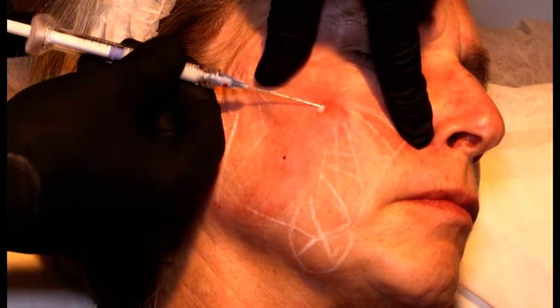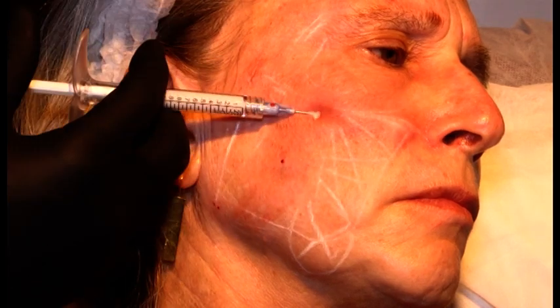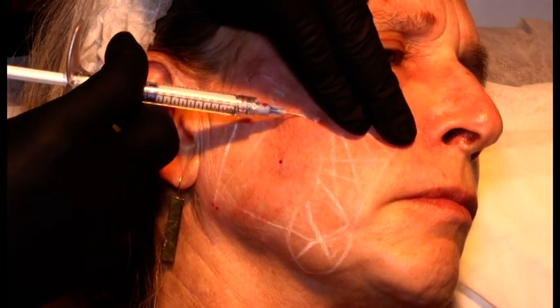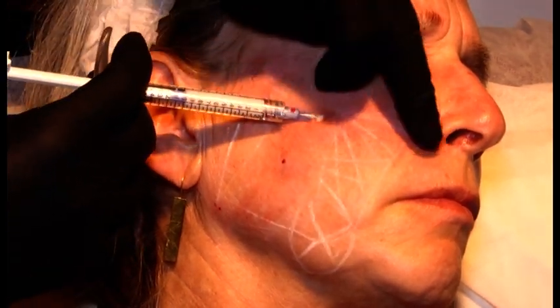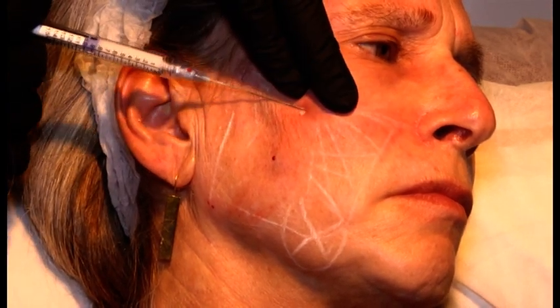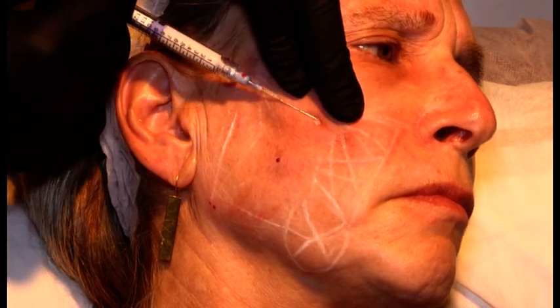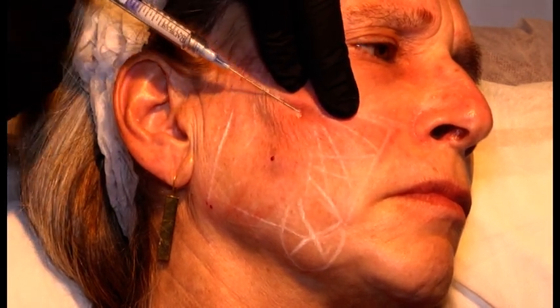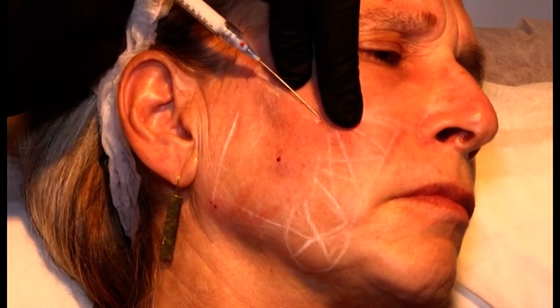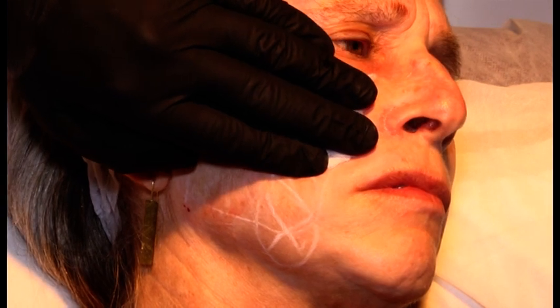So stretch the skin, advance the cannula at the dermal-subdermal junction. And you know, this is where there is the facial artery, also in this area, so we have to be gentle here. And okay, you know what? I'm gonna stop using this syringe. Do you mind if I show them how to mix?